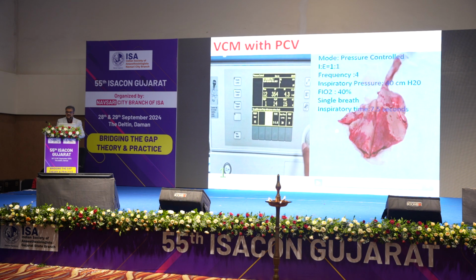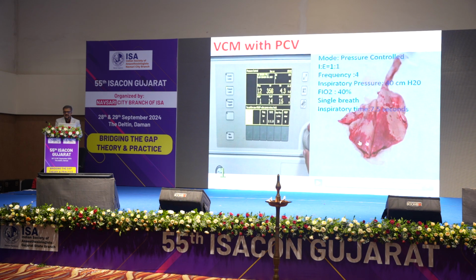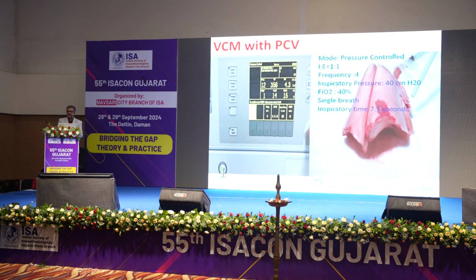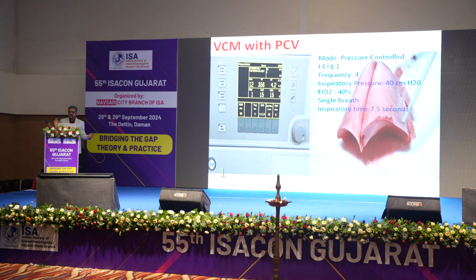So this is another way to recruit the lung. Now look at this. This is a real-time video, a 7.5 second video, and these red colored areas are atelectatic areas. Look at how it's recruited. Completely open lung. This is how you should recruit the lung.